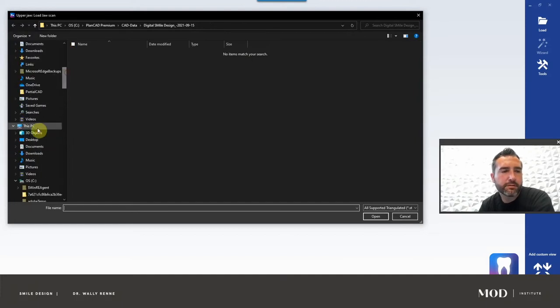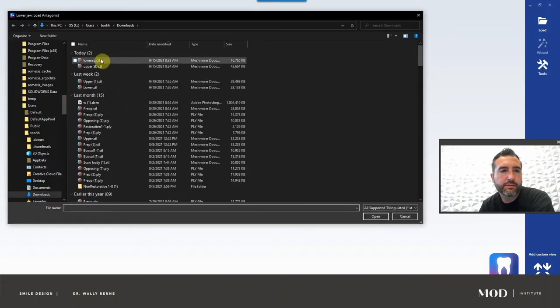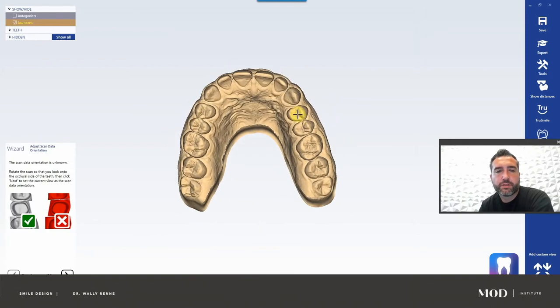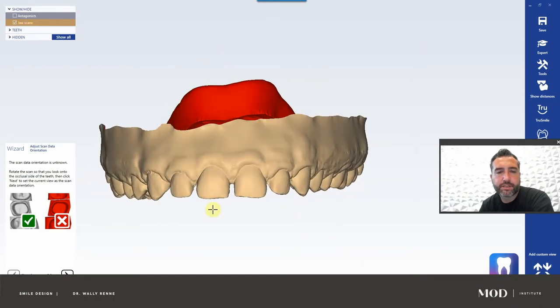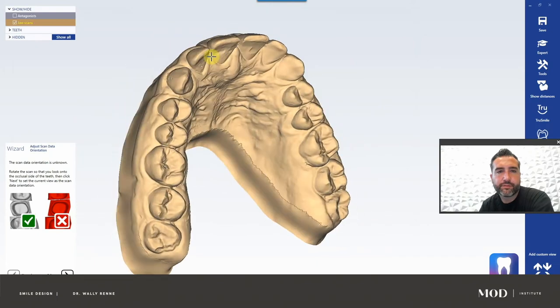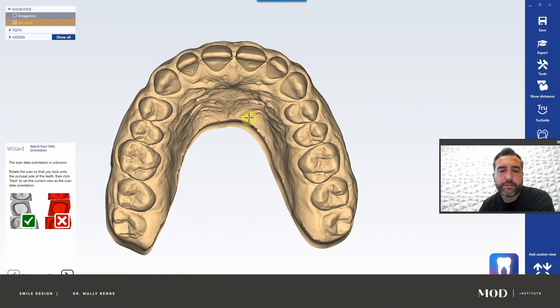Find the files — mine are under downloads. It's asking for the upper, so we're going to load the upper SD, and then load the lower SD. Here is the model. We have spacing, we have some compensatory eruption that's occurred, we have a Bolton discrepancy, and we have wear facets here and here that are very aggressive for such a young lady. So we have a lot of different issues going on with this patient.